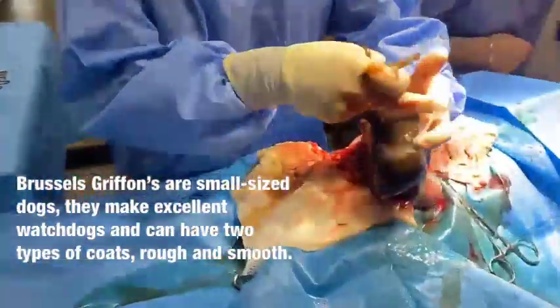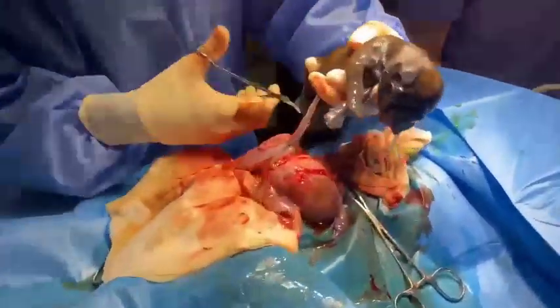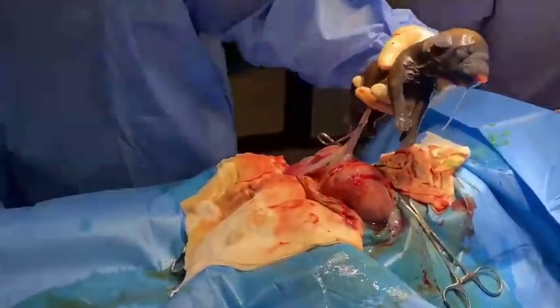We're delivering these puppies by cesarean today. These are Griffin puppies — there are three in the litter, all nice healthy puppies.